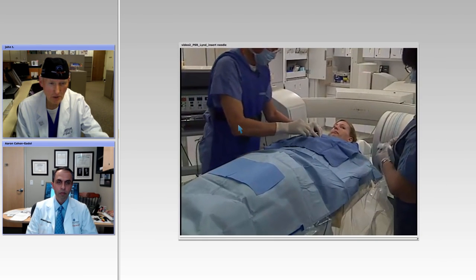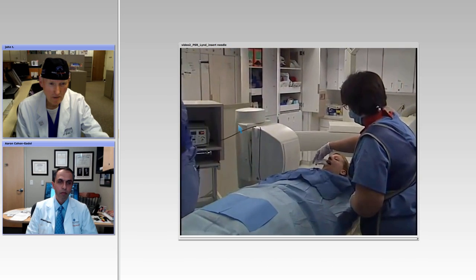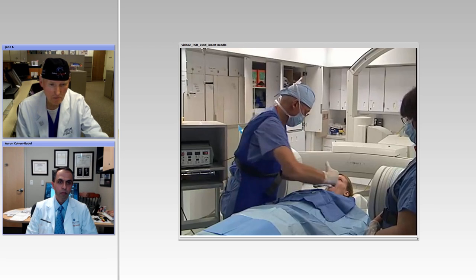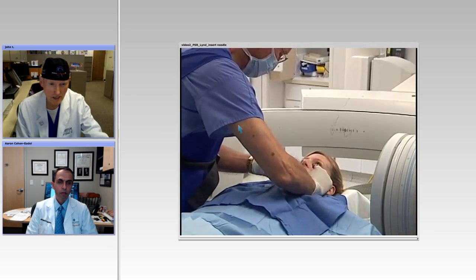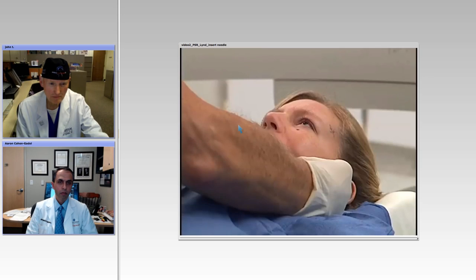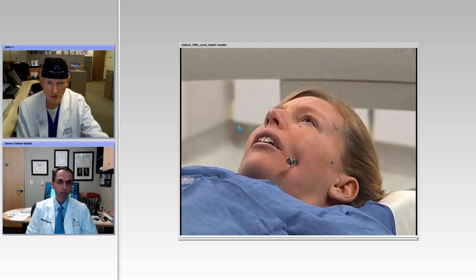So here we are actually doing a patient, and you see the block going between the teeth. The nurse anesthetist will inject the Brevital, and when the patient is adequately anesthetized, which takes less than 30 seconds, the cannula is placed and the surgeon is guiding it in place. And here you see the lateral fluoroscopic image showing the placement. And within another 30 seconds or even less, the patient is awake and cooperative again.